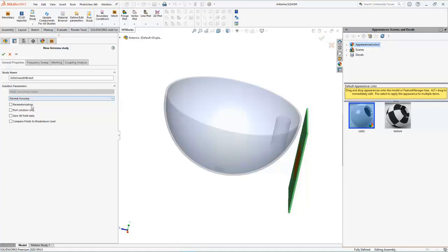You can also use the parametrization feature to create a parametric study. For example, here you can parameterize the depth of the tumor and run multiple analyses automatically, then examine the results and pick the optimal one. Port solution only allows you to get the 2D port solution, and the other option, save 3D field data, adds 3D field results.